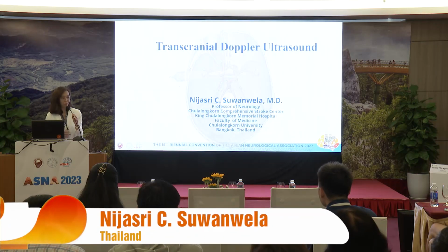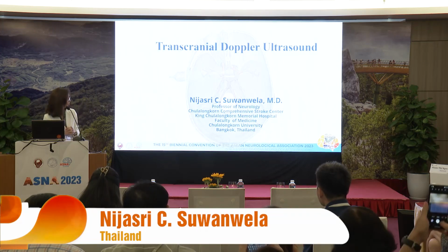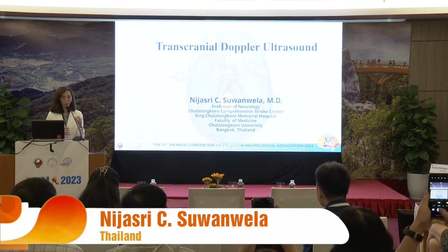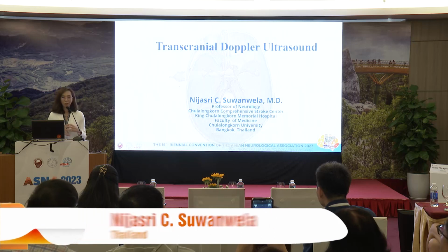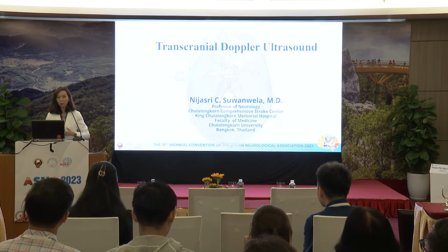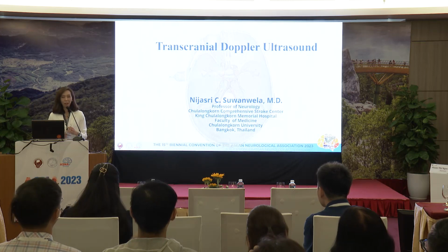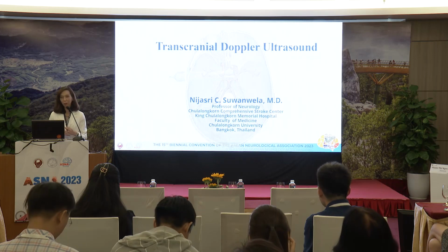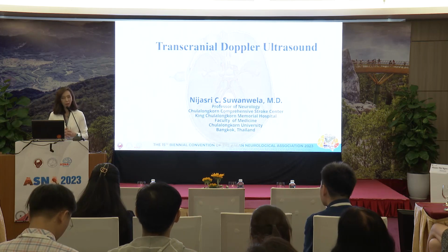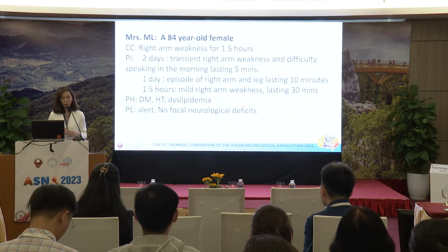So, I think for better flow, I'll just move on to the TCD part. I think my life is much easier after Dr. Romani has already mentioned everything. For TCD, it's pretty much similar to TCCD, except for the blindness. I mean, we don't see the arteries, the pictures, or the anatomy, but we can still work on it. So let's start with a case.